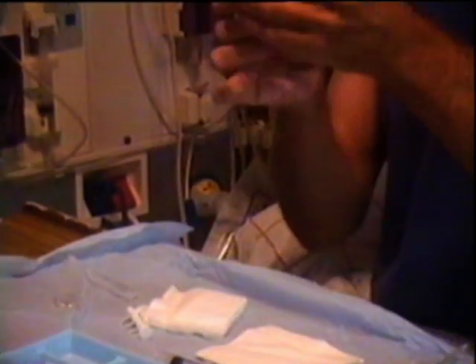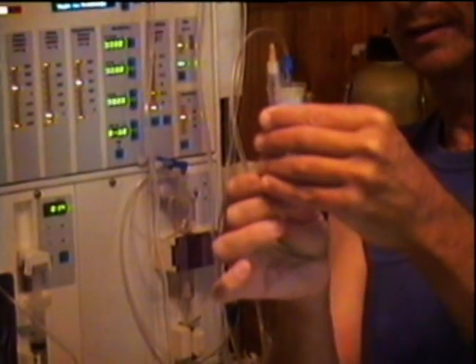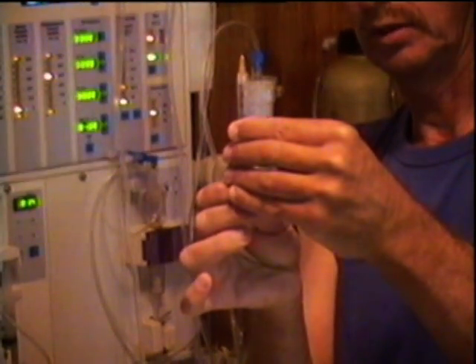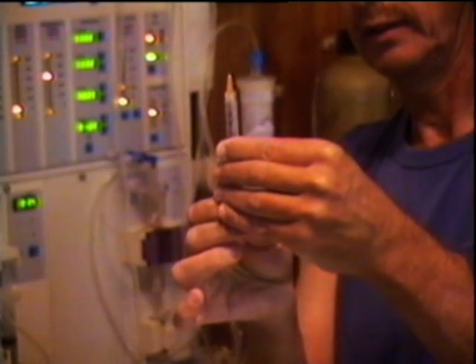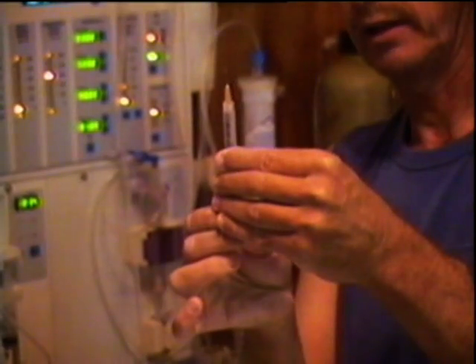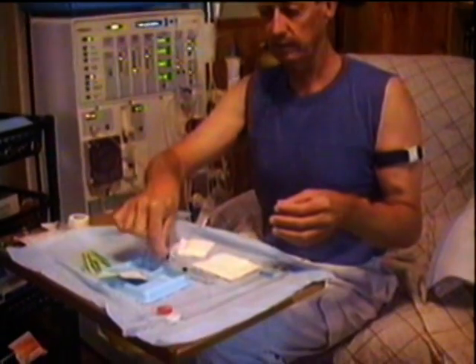You can still feel it when you put it into your skin, but it's not too bad. The worst part is it stings a little bit when you put the local in. I'm just getting the air out of it — I've got a couple of squirts done. So that's ready to go now.